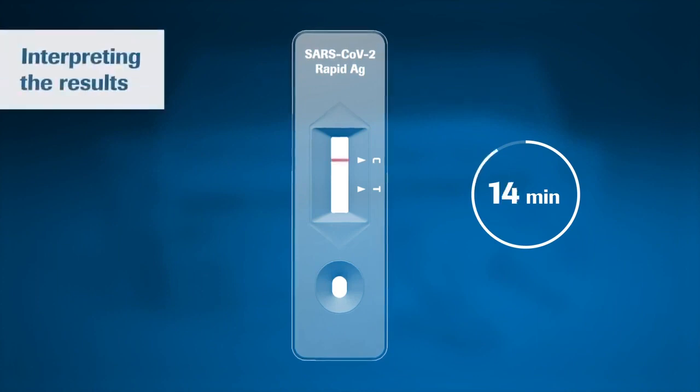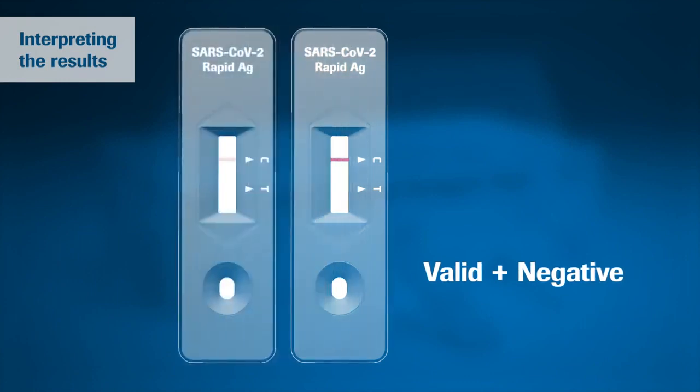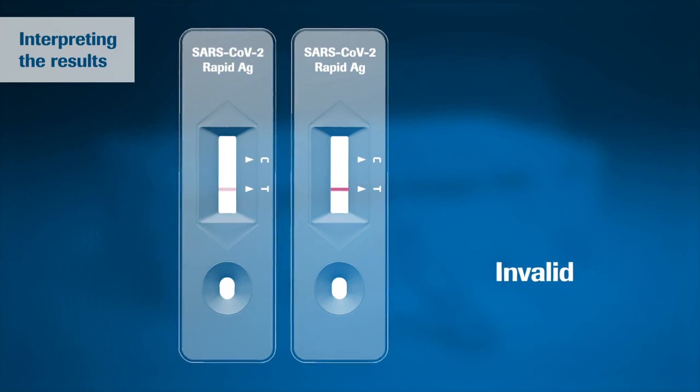A colored line appears in the top section of the result window to show that the test is working properly. This is the control line C. Even if the control line is faint, the test should be considered to have been performed properly. However, in both cases, the test is negative. If no control line C is visible, the test is always invalid.